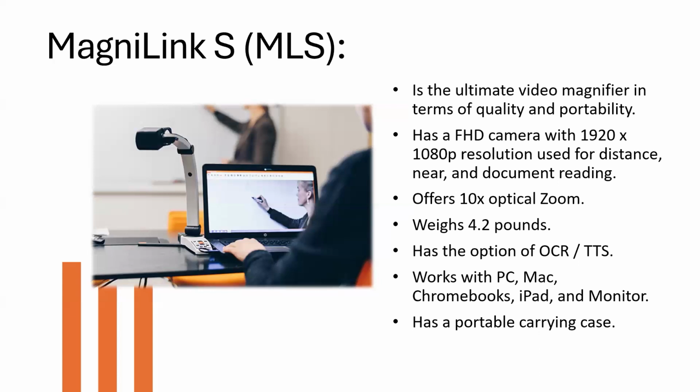If you're using it with an iPad, which we're showing today, it automatically has the TTS. You don't have to purchase a license, but if you are using it with PC, Mac, or Chrome, there is a licensing fee for that TTS because we have to pay the licensing fee ourselves. It is just a one-time fee. It's not an annual renewal, so don't get that confused with some AI things that we talk about today. So the text to speech, we're not changing. Those are a one-time licensing fee.